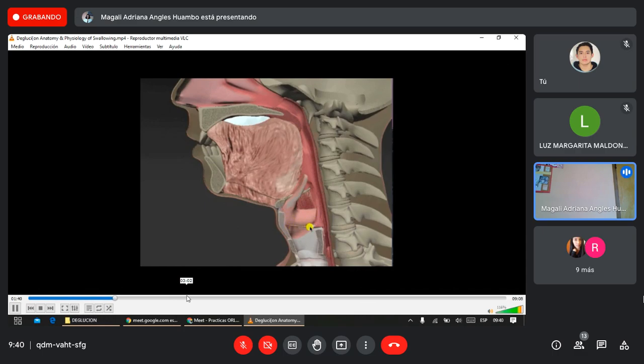This thin white shape is the line representing the true vocal folds, with the arytenoid cartilage, this triangular shaped structure behind here, where the vocal folds attach. This is the cricoid cartilage below. The posterior cricoid cartilage and the region of the posterior pharyngeal wall here, in and around cervical vertebra 5-6, is where the pharyngoesophageal segment is located. And your trachea, of course, is here, and your esophagus would be below.